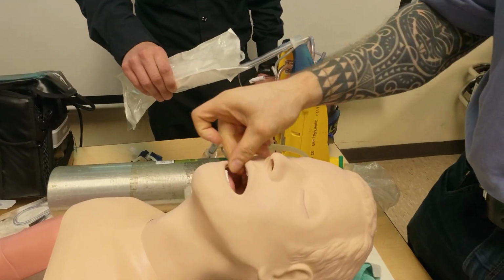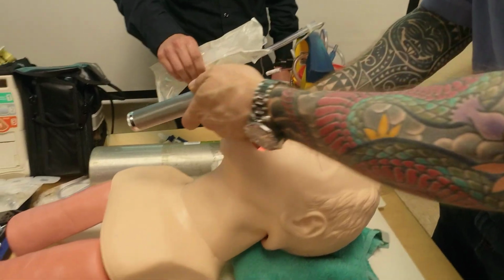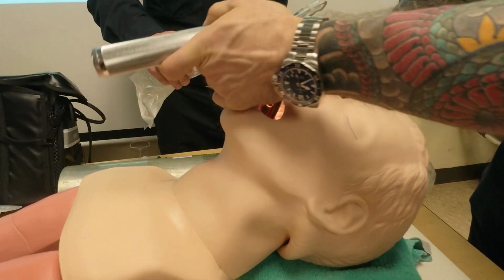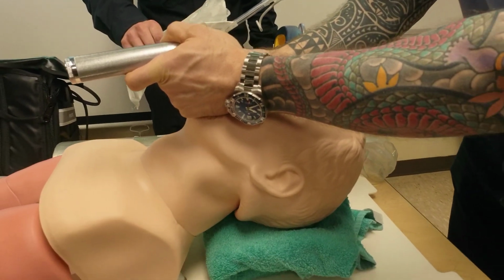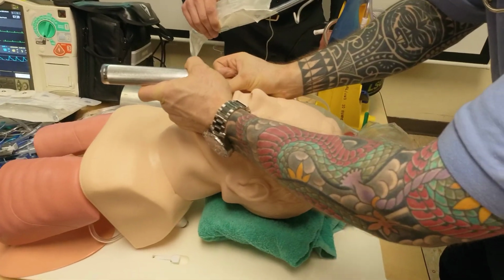If the guy is in cardiac arrest, you could do this cross finger, but I usually use my thumb. Come in from the side like this. We're going to go slowly. I'm not jamming my blade all the way in. You inch along the tongue until I see the first structure, called the epiglottis. I want to see the epiglottis. Once I see the epiglottis, I'm going to slide my blade into the vallecular space.